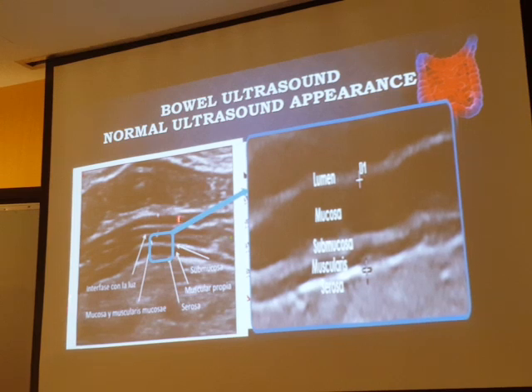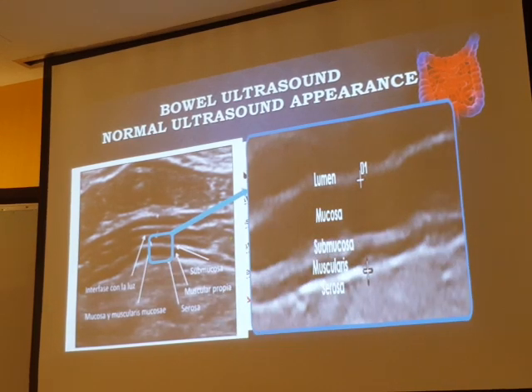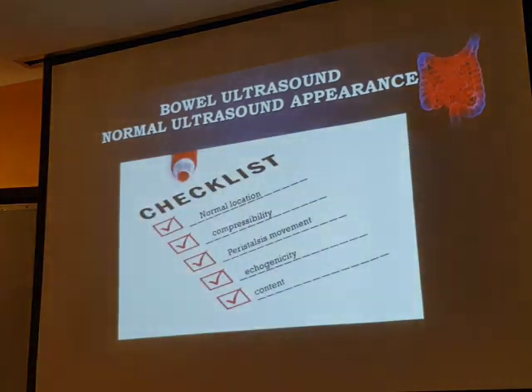So we have to measure it from here to here, and from here to here. Do not measure the whole diameter of the bowel, to provide you a good thickness. Good thickness provides good information for a healthy bowel.